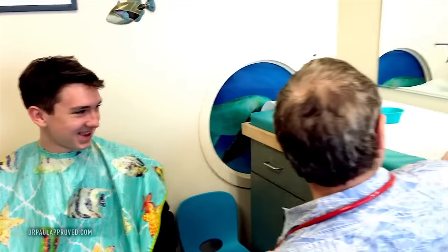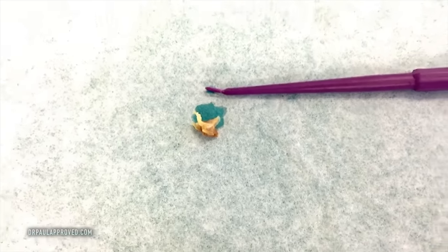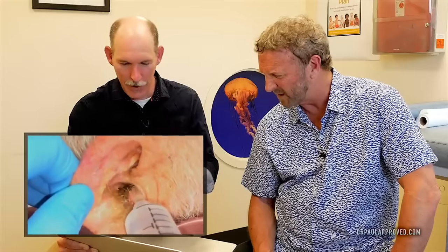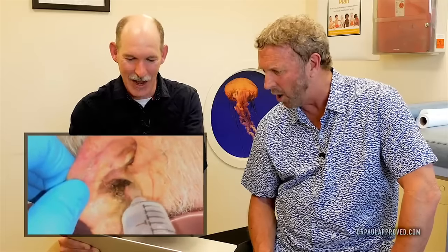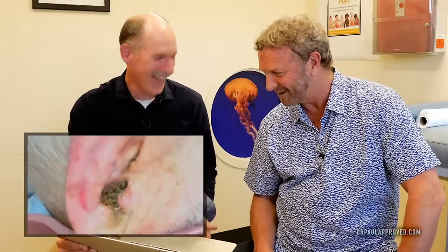Oh jeez. We'll put it right here on the table. And now I'm going to take a look in there and just see. All right. Look at this — look at another big old chunk. That's a good one. You know, you're good. That's a good one.